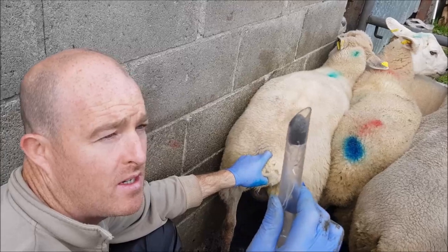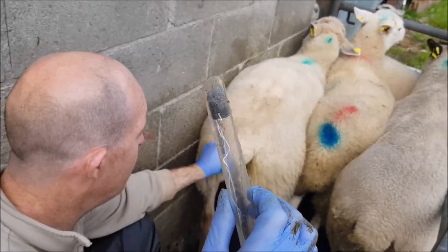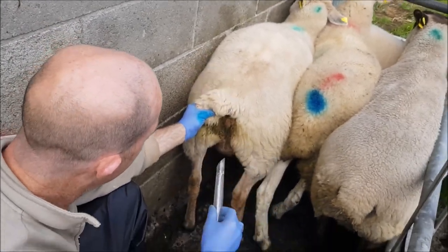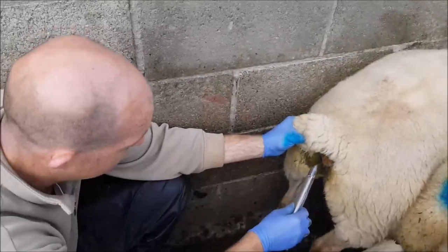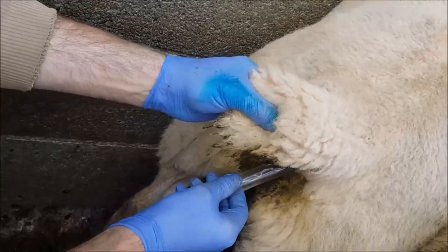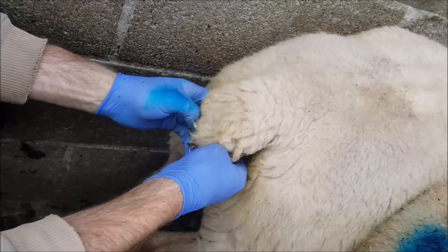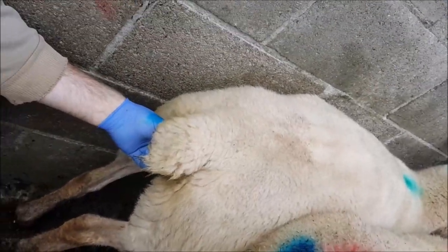So here we are putting in the sponge. The sponge is in the applicator with obstetric gel on the tip of it, just to make it go in easier. Slip it into the vagina and upwards, and it should go in easy — it will definitely go in easy for any sheep that has had lambs before.